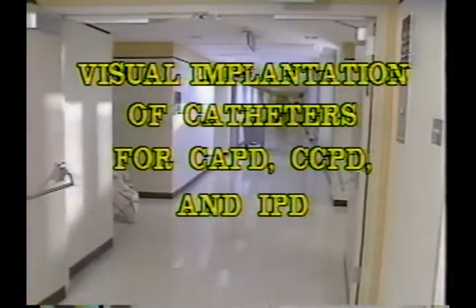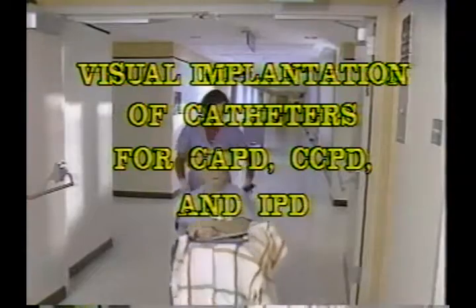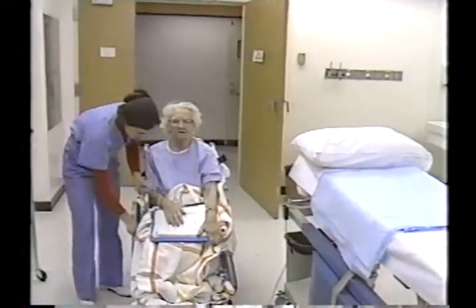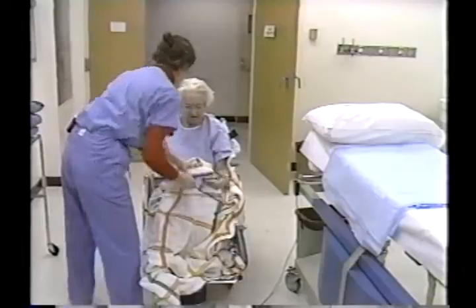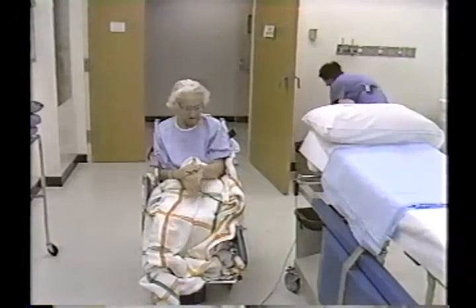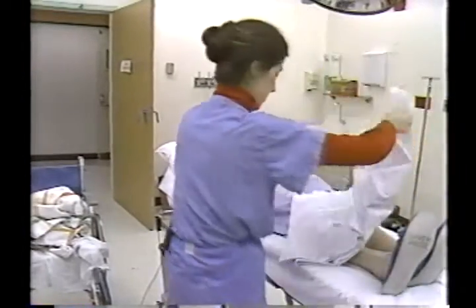The Metagroup system is designed to allow visual implantation of catheters for CAPD, CCPD, and IPD. Accuracy, safety, and efficacy of catheter placement are improved with the system. The procedure is performed on the ward or special procedure room, intensive care unit, or dialysis unit. The patient is awake, NPO for 8 to 10 hours, and has emptied their bladder.